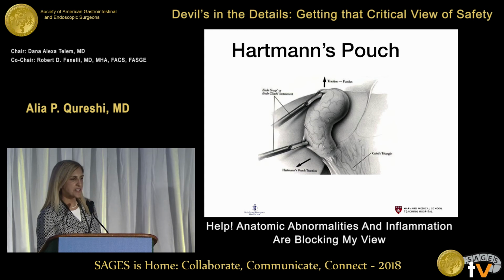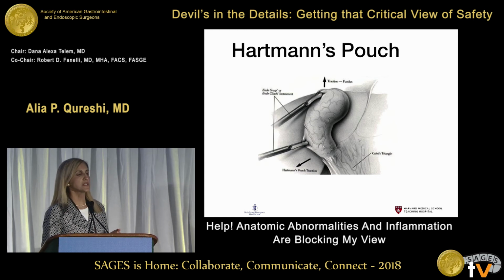So with regards to retraction, I've mentioned it a couple of times. You want to take your lateral grasper, at least this is how I was taught in my training, and this is what I do every time. And it's always a step-by-step recipe. So the fundus is retracted over the dome of the liver with the lateral grasper. The medial grasper is used to grasp Hartmann's pouch to the right lower quadrant, and those are critical moves. And if you don't do those, you're setting yourself up for difficulty.